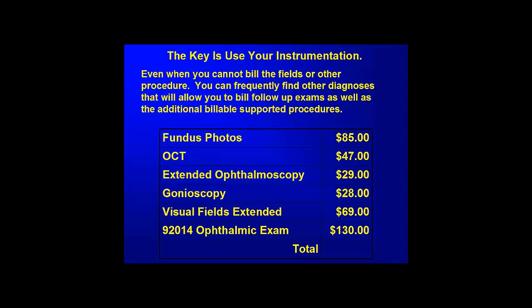So one of the other things is you start doing this now, even when, as I said, you can't bill the fields or the other procedure, you're finding diagnosis codes that you'll bill for follow-up exams and additional billing support procedures. So again, it becomes a significant increase in reimbursement.